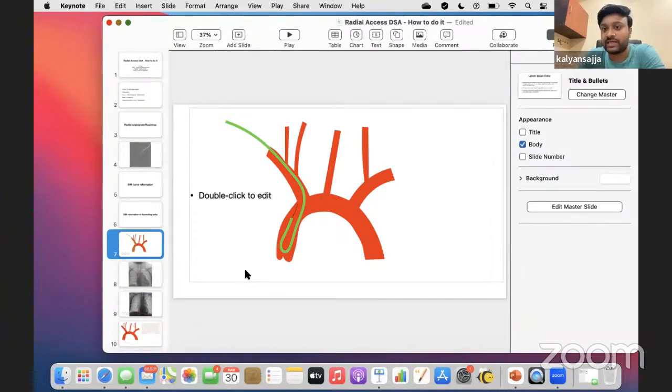Sometimes you just have to untwist and twist a few times, and luckily it'll just go into the left vert. Many asked me about how to access the left common. If you just maintain the figure of 8 into the left vert and jump into the left common, that's the best way to go about that.